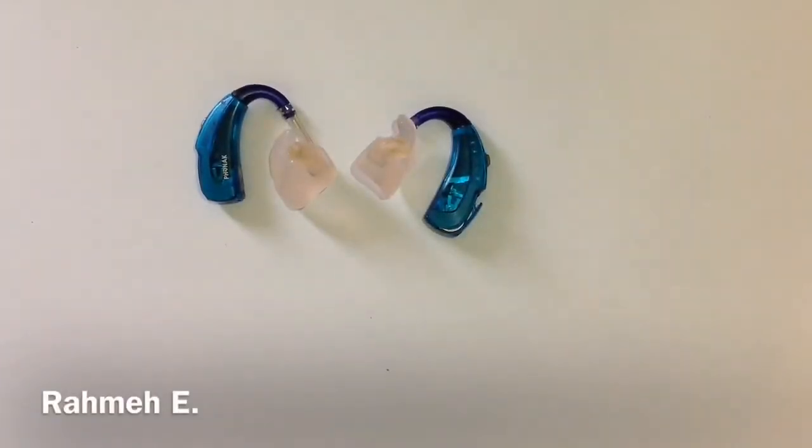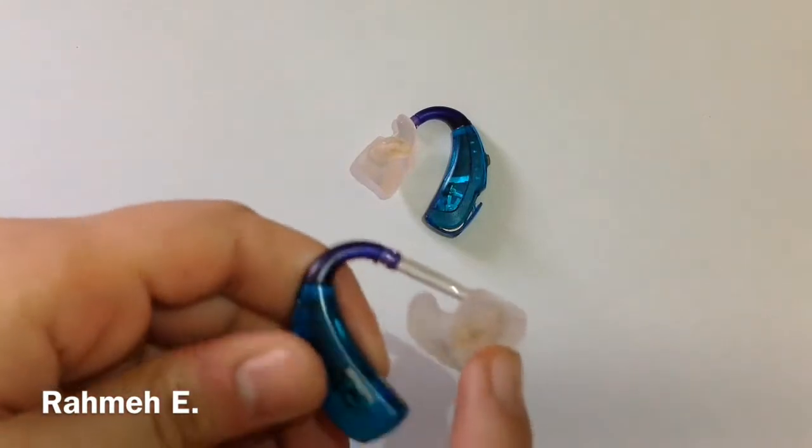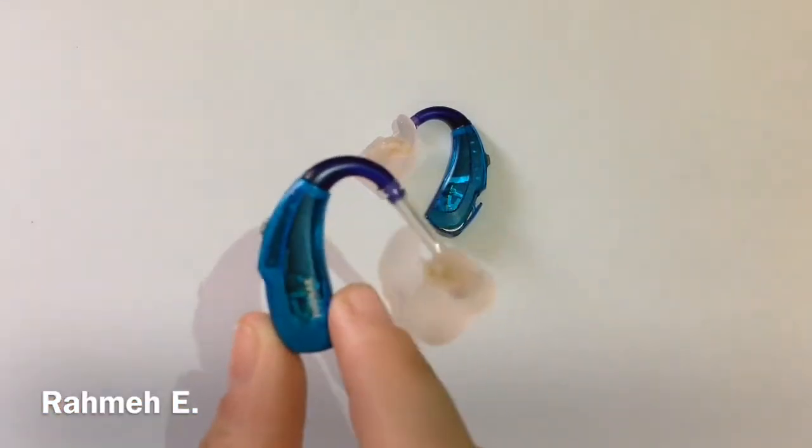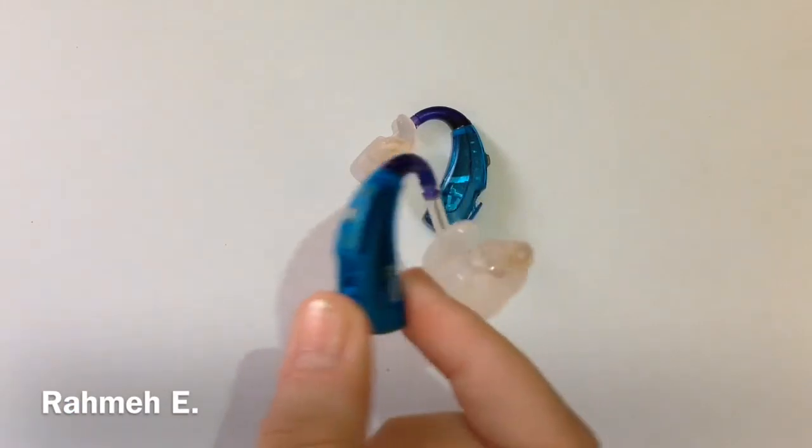I'm going to be going from the ear mold and up here and down here, and that's how I'm going to be showing you guys the different parts of a Phonak Sky hearing aid.